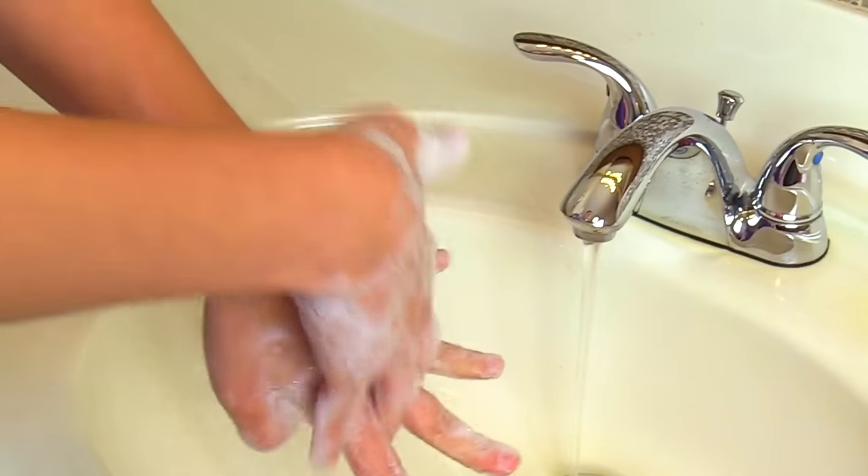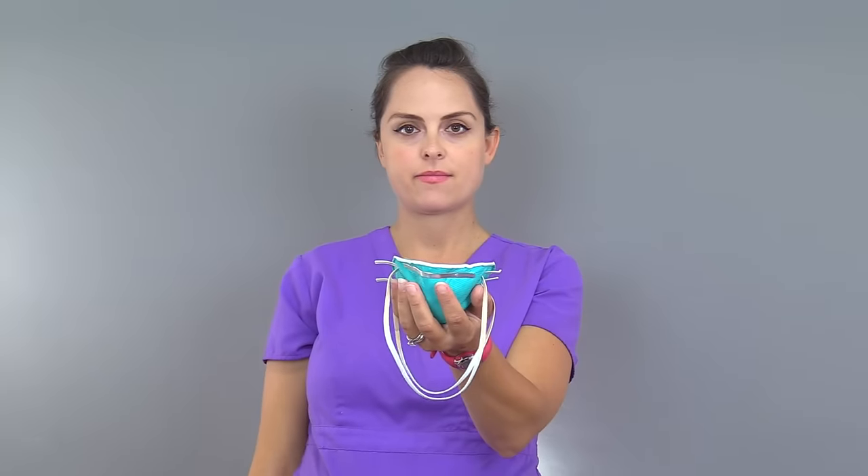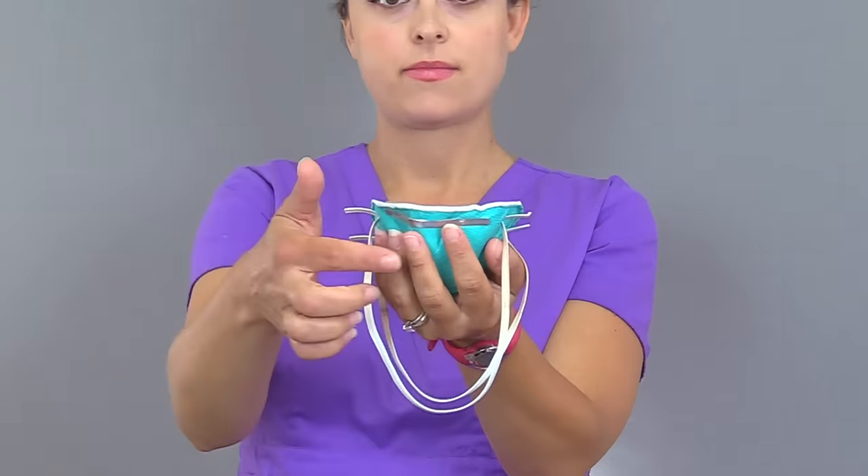First, you want to perform hand hygiene. Hold the respirator in one hand, with the front of the respirator touching the inside of your hand. The metal nose piece should rest near the fingertips. Be sure the top and bottom straps of the respirator are hanging down below your hand and are not tangled or twisted.